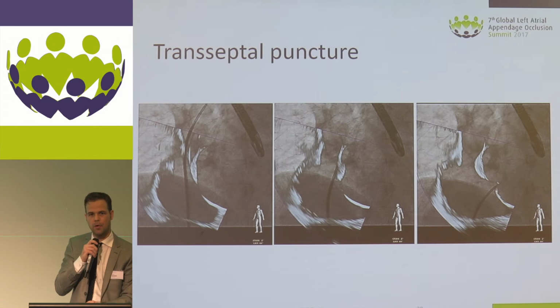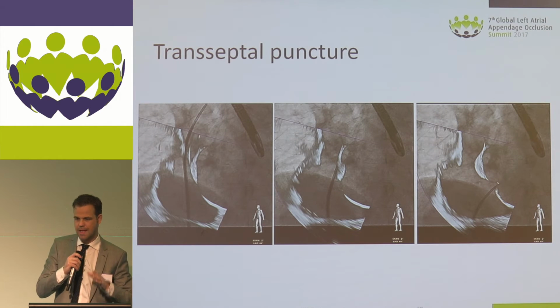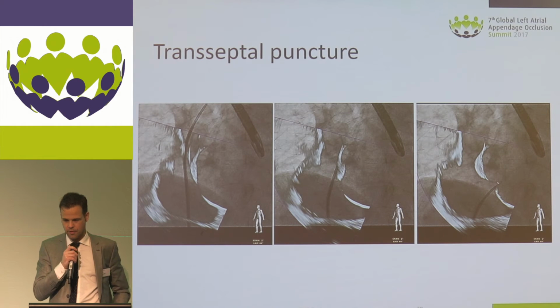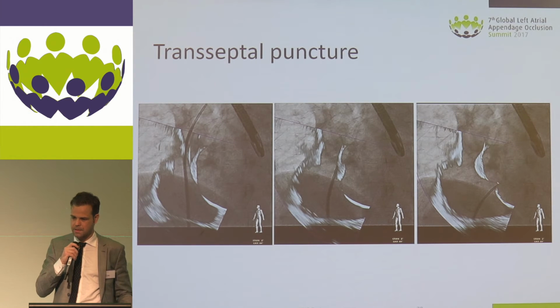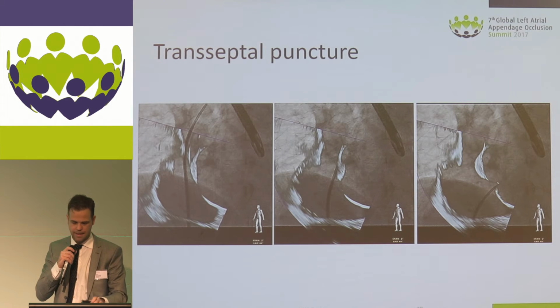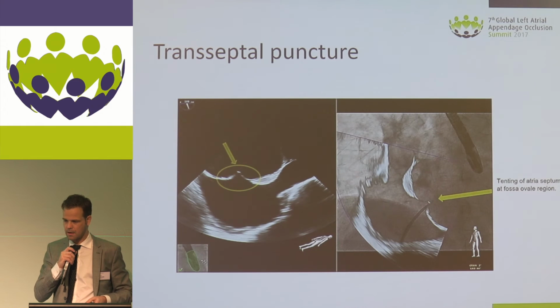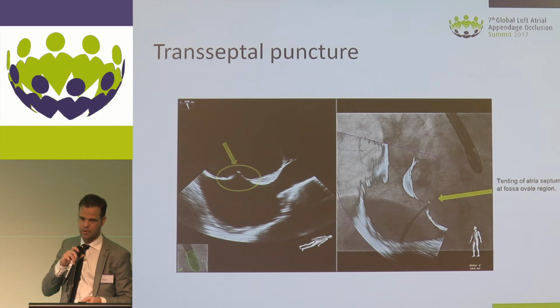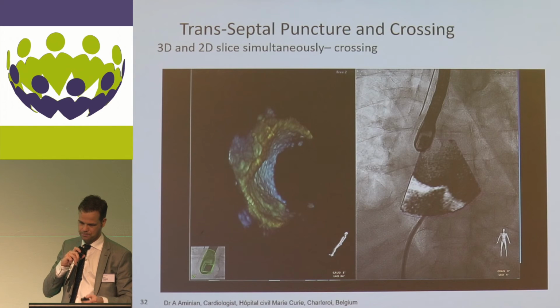What we now more and more do is, because AP is not always the right view to do the transseptal puncture, we rotate the angulation of the tube until we have a nice bicaval view, insert the needle in the SVC and go down until we see the needle dropping into the fossa ovalis, and there do the puncture. You already saw this, but very nicely, good correlation with the images, and immediately you have an understanding of where you're looking, because that's sometimes quite difficult to understand in complex anatomies.